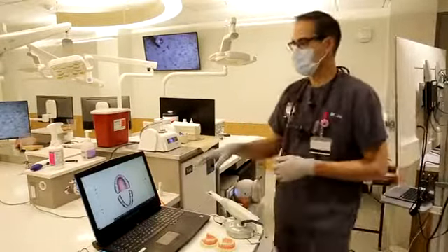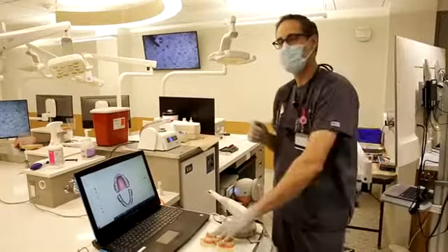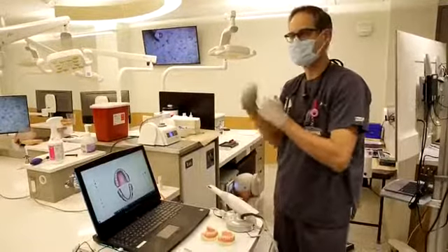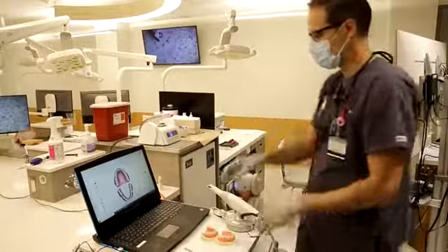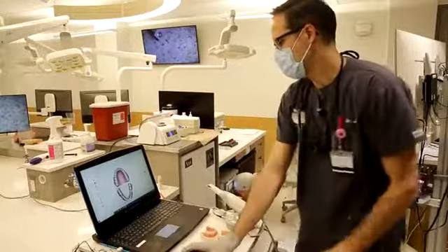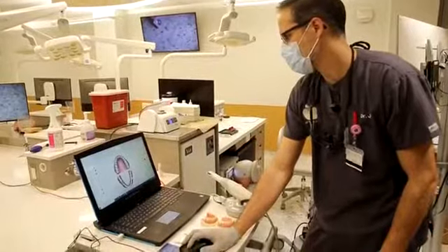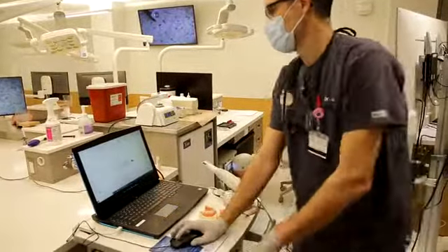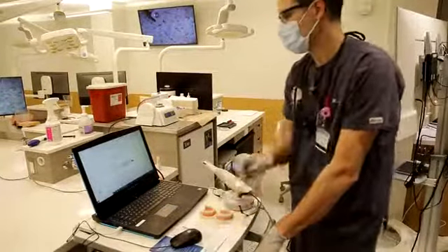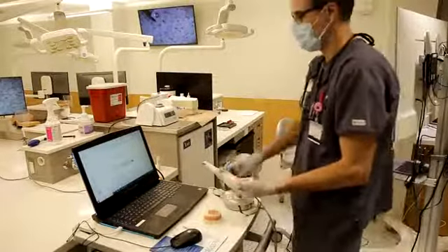So I'm going to go through how we actually do the scanning for our patients. We have that same fake model that I used on the Moravision and our Typodont, or our mannequin. So we're going to do this scan. Normally, again, this would be done intraorally. After we pick the tooth that we need, this is a pretty easy process, so we're going to go to the scanning page. When we get to this page and we've got our scanner ready, we're going to pick the lower arch that we want to scan. This is the arch that has the preparation on it.